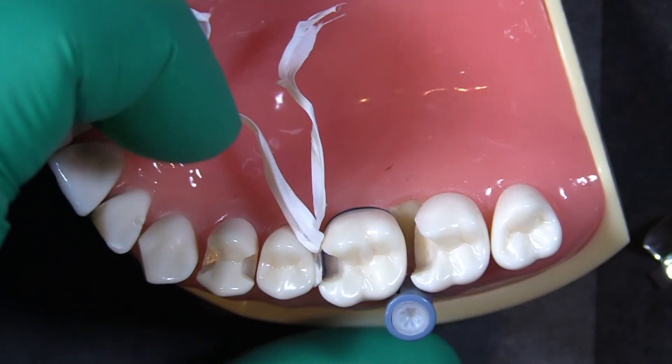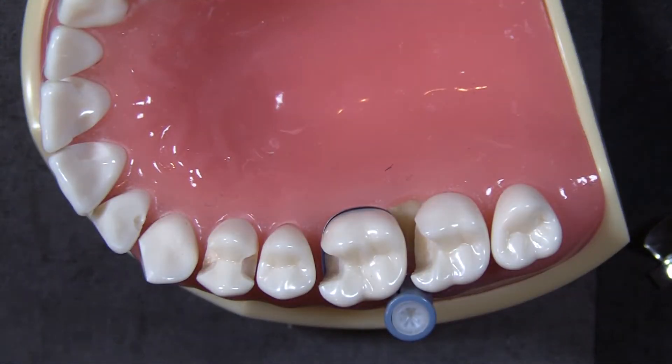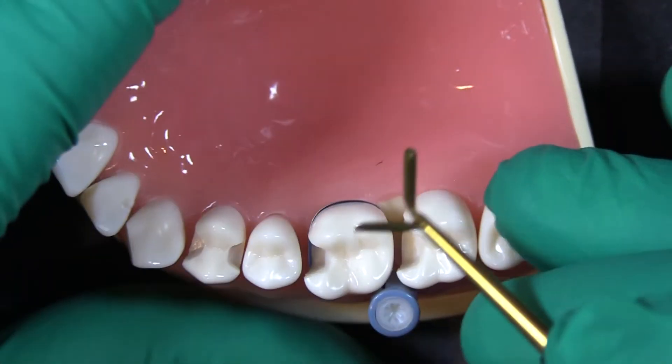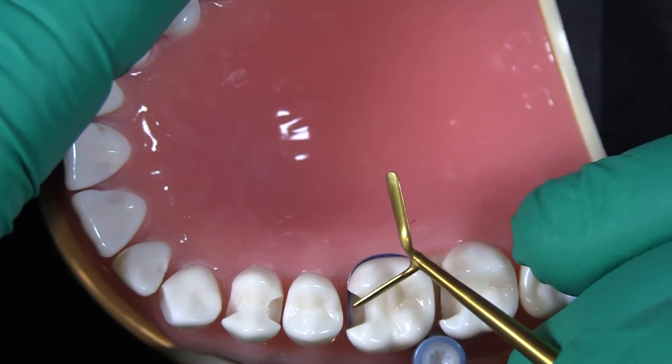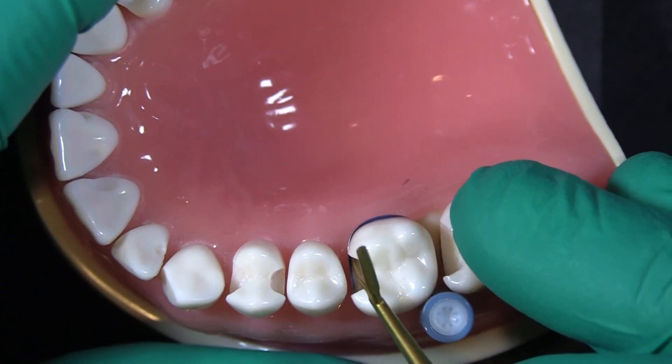That's our number one goal. One thing I always do and always recommend is to take an explorer, or use your magnification, and look to make sure you didn't trap any little bit of gum tissue between the matrix band and the tooth.